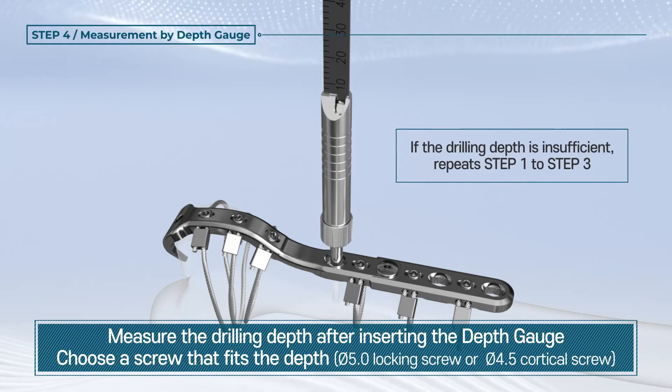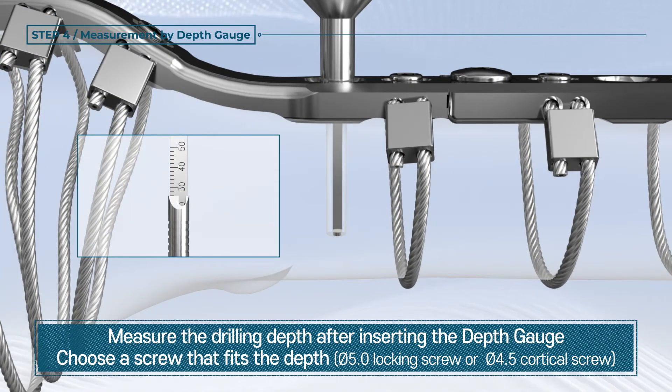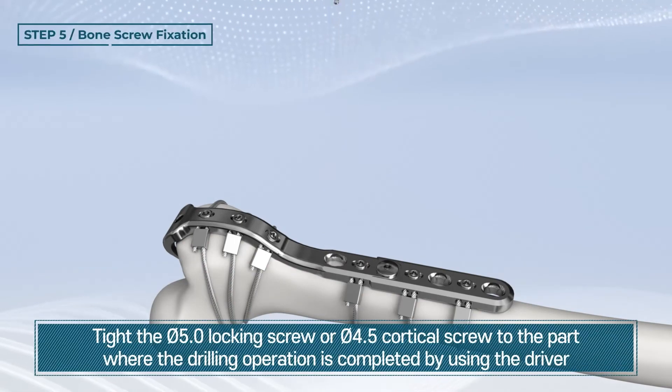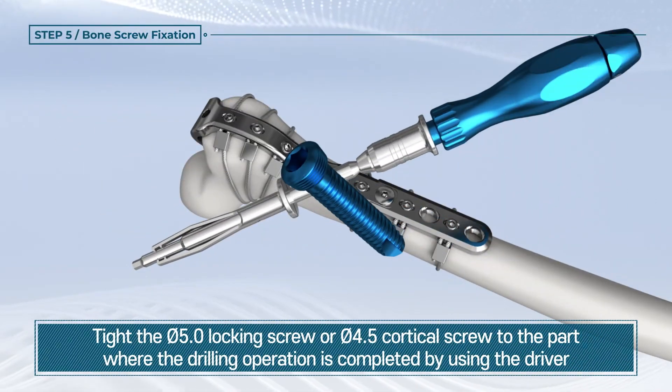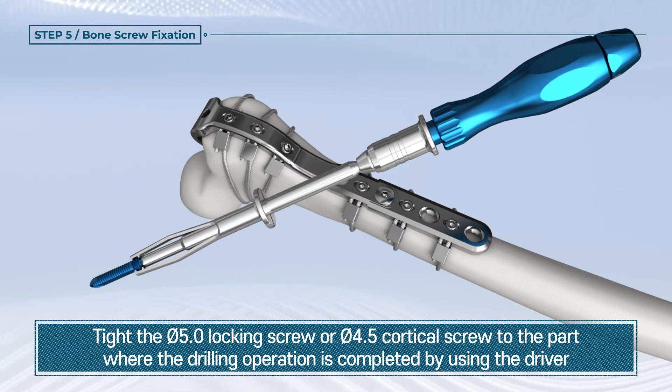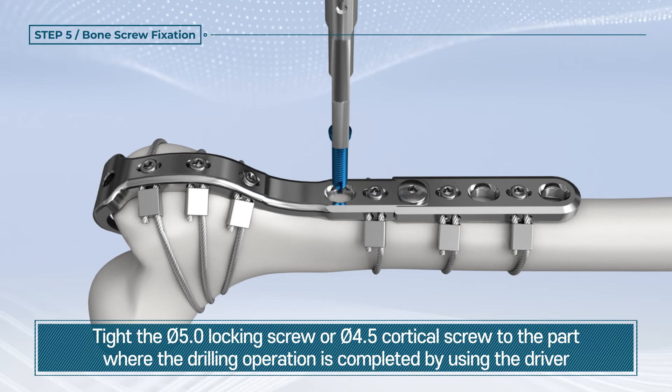Insert the depth gauge into where the drilling operation is completed. Measure the depth of drilling and select the bone screw suitable for the depth. Tighten the 5.0 mm locking cortex screw or 4.5 mm cortical screw to the part where the drilling operation is completed by using the driver.